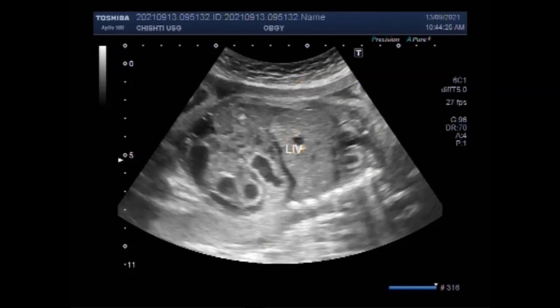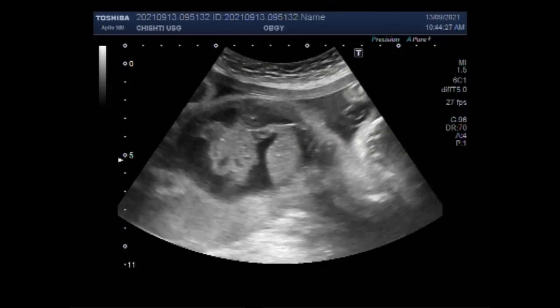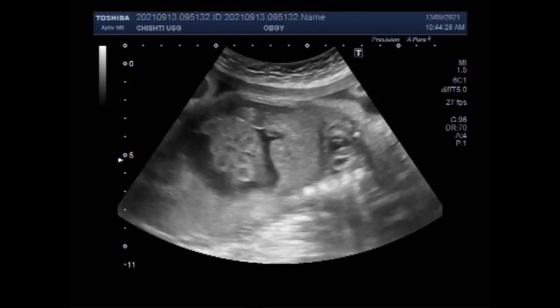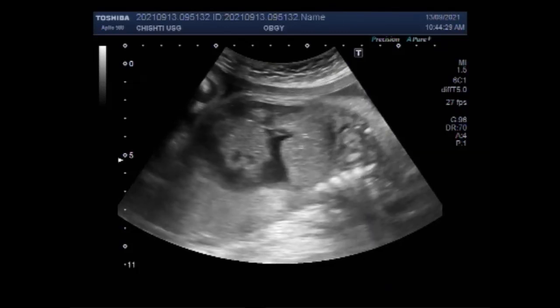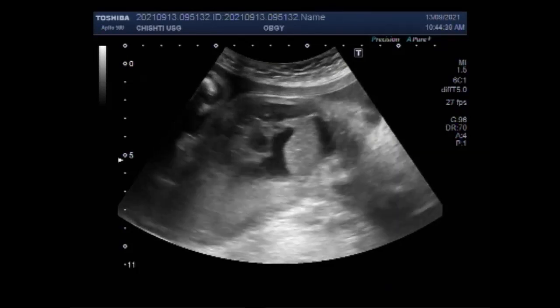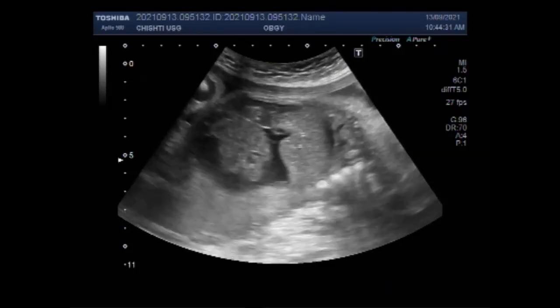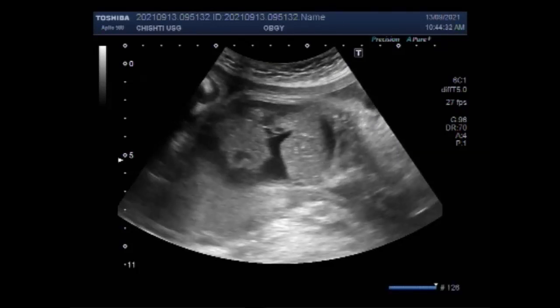Now you can see the liver. Ascites is also visible — the free fluid can be seen here as well.